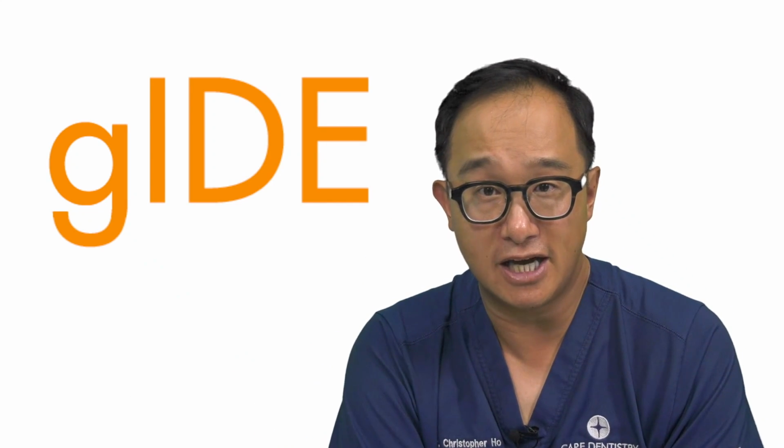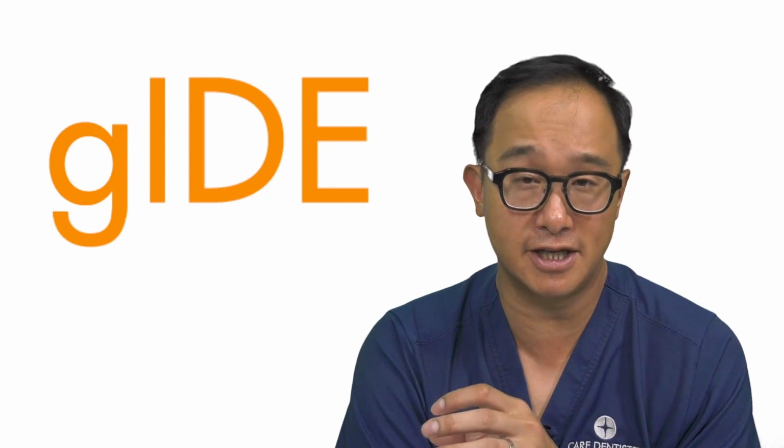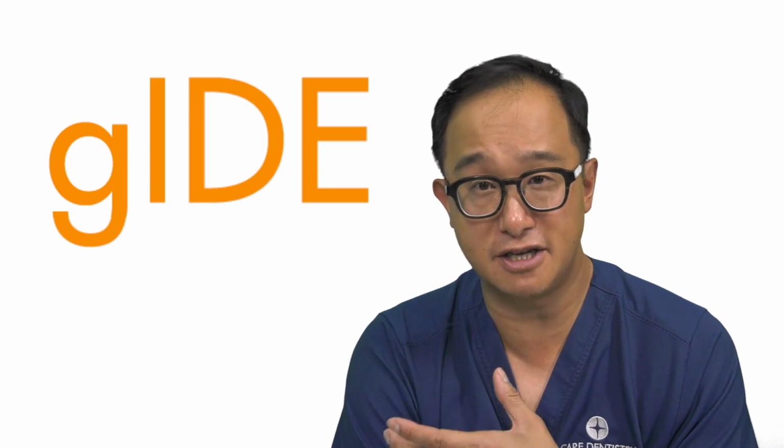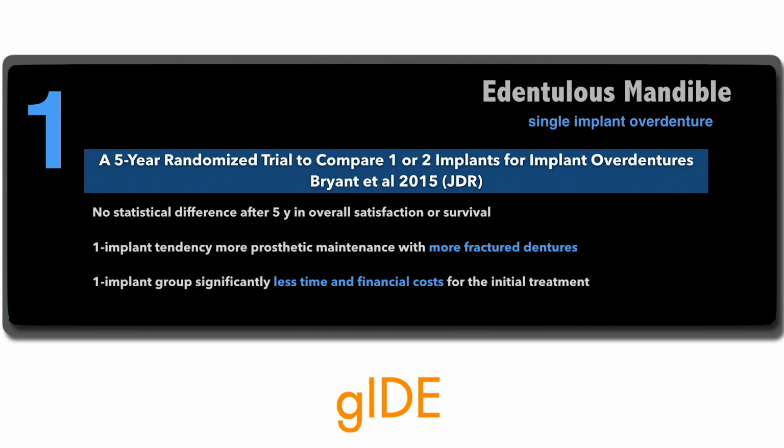So they recommended to have a framework, a metallic framework within the acrylic, which would reinforce the overdenture and maybe minimize the amount of fractures that occurred. But with a single implant overdenture, there's less cost for the patient, and also less time for the patient.